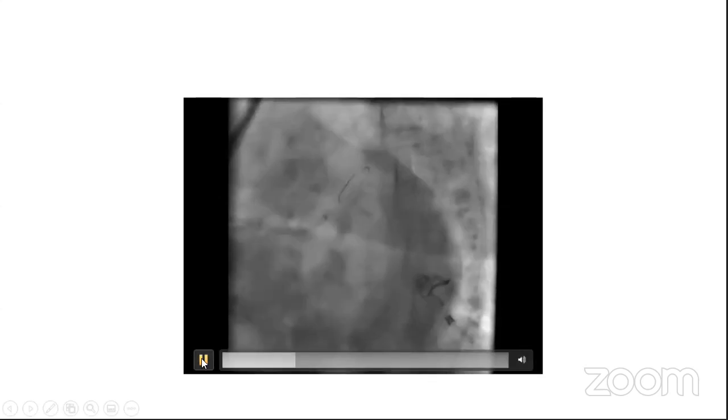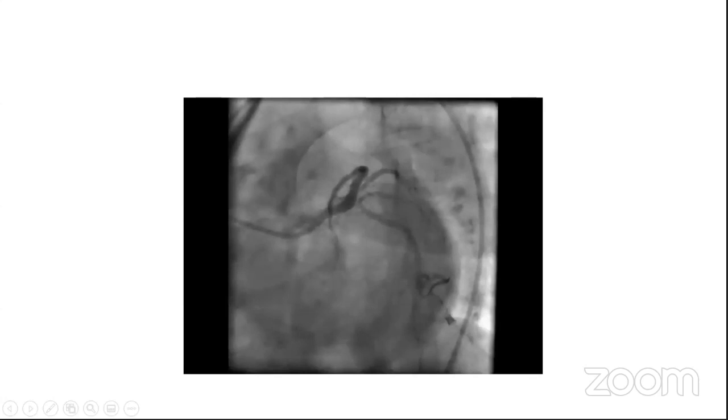Haysem Suleiman, this is without any wires, would you like to comment on anything on this angiographic view? Actually, you did a great job, Zahran. I totally agree with Karim that now is the role of the extensive medical treatment. You did a great job to the tight lesions. You've corrected all of them, and let the medical treatment do its job.